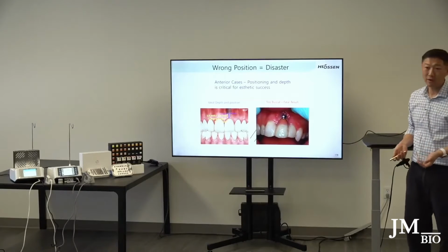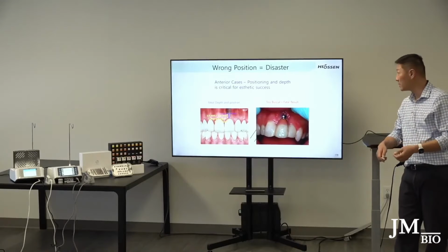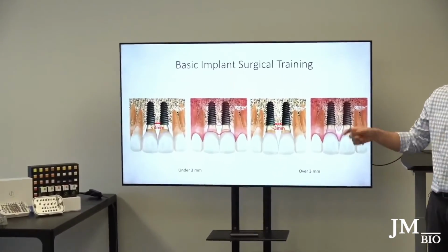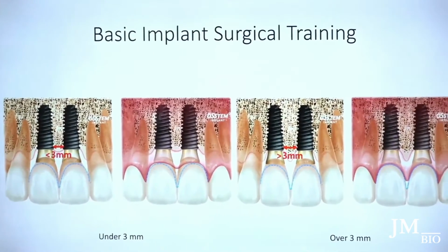That's key. The prosthetic standpoint is key. So you have to think of it from the crown down. Always think of it from the crown down. It makes it a lot tougher when you think of it that way, because there are so many variables, and the bone is not always where you want it to be. Unfortunately, life doesn't happen that way.